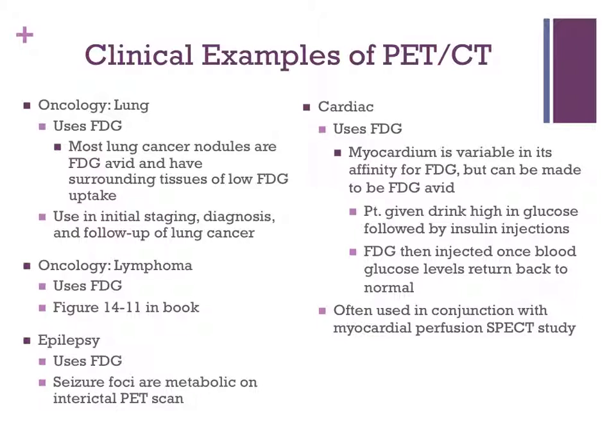Oncology, as far as lymphoma goes, is another clinical example of where PET CT is used, and this also uses FDG. Epilepsy is another clinical example. This as well uses FDG, and it's been proven to be useful in the localization of epileptic seizures.